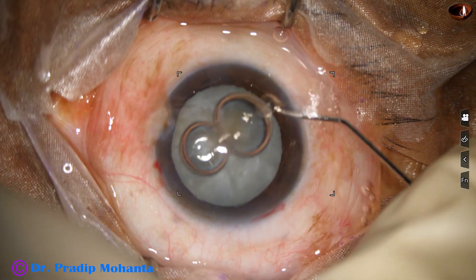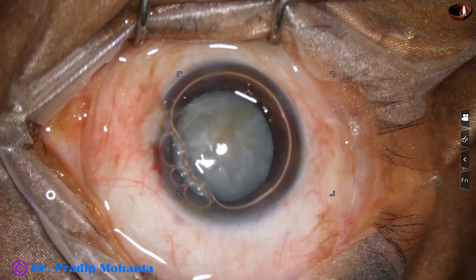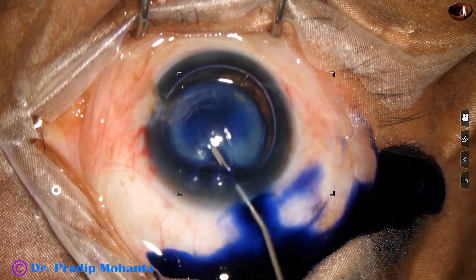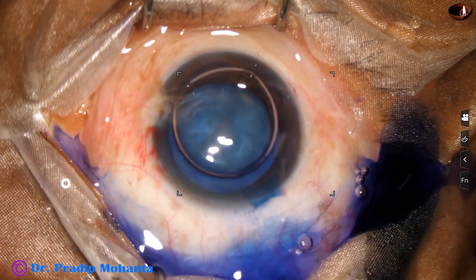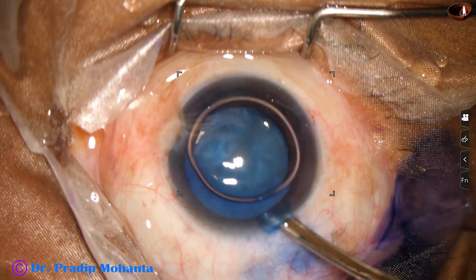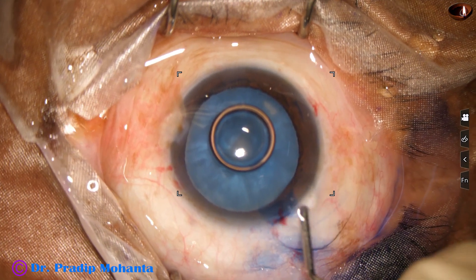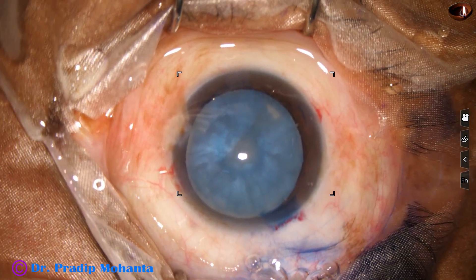An air bubble is injected to fill the anterior chamber. Beneath this air bubble, trypan blue dye is applied in such a way that the dye touches all parts of the anterior capsule. A bit of adrenaline is added, then the dye is washed out with a Simcoe cannula using BSS. If we wash the dye out, the concentration of the dye is uniform all around and visibility is good.